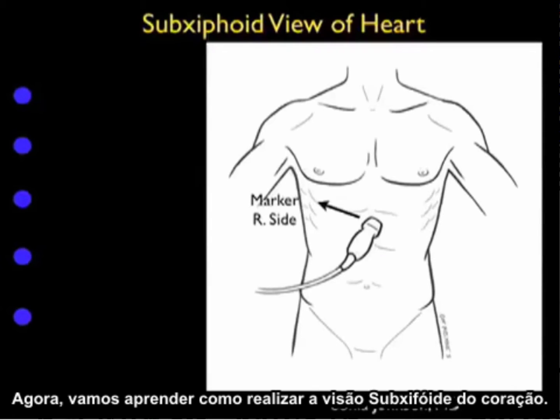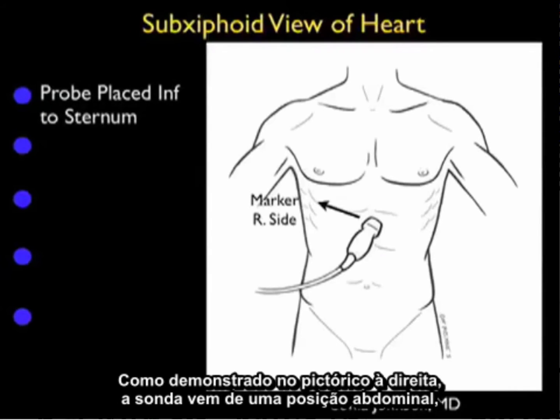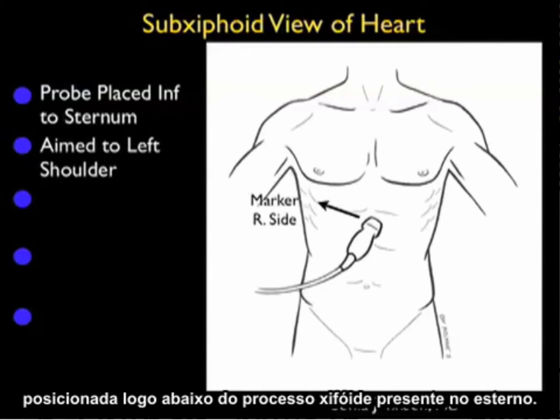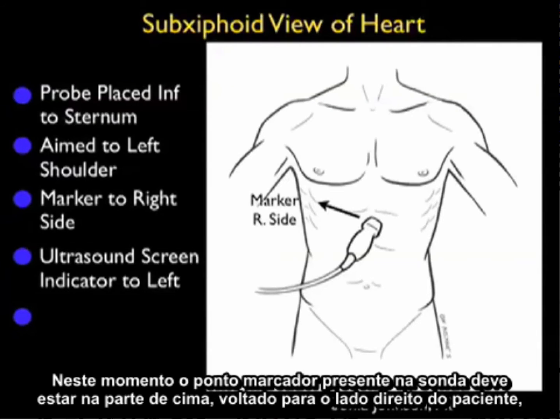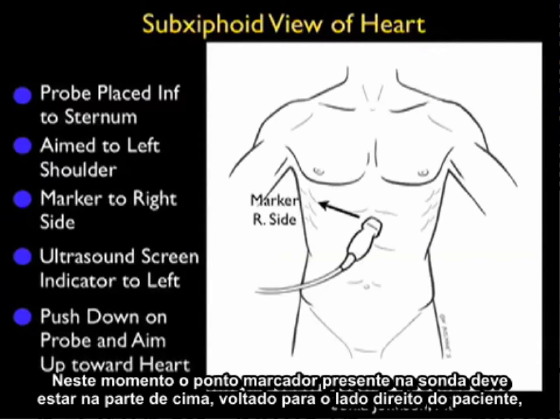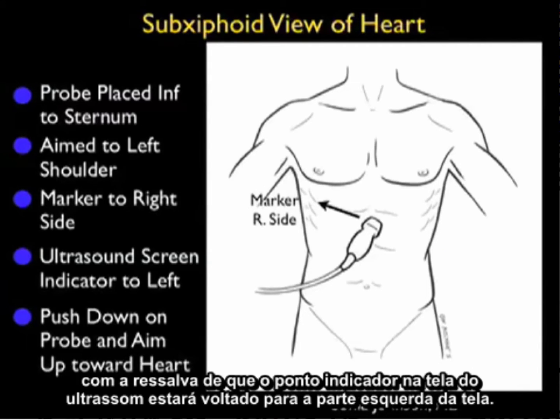Now let's learn how to perform the subxiphoid view of the heart. As shown in the pictorial to the right, the probe is coming from an abdominal position placed just inferior to the xiphoid tip of the sternum. It's important to lay the probe flat and push down and under the sternum, aiming towards the patient's left shoulder. The marker dot on the probe should be over towards the patient's right side, with the caveat that the ultrasound screen indicator dot is over towards the left of the screen.